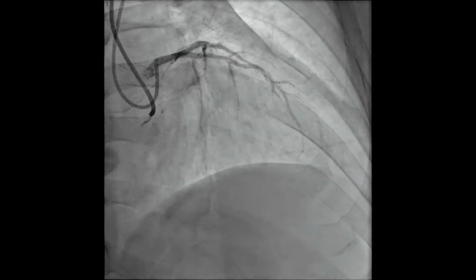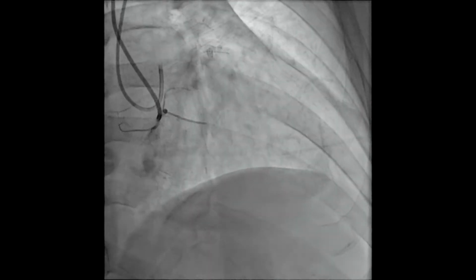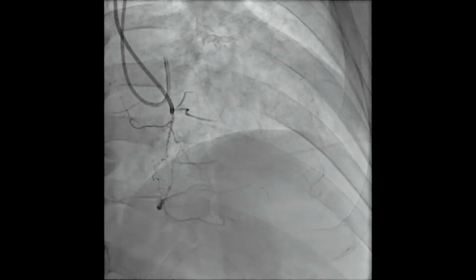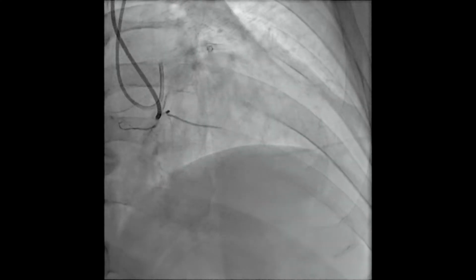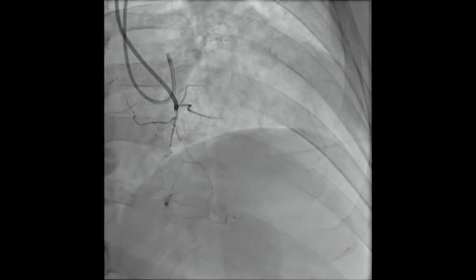So a case. This is a 56-year-old man who had a non-STEMI, had a circumflex PCI, and just like 20% of patients who come to the cath lab, was noted to have a CTO as well of the right coronary. He never felt great after his circumflex PCI, so he came in for evaluation. He was on 3 antianginals with a great blood pressure. Stress testing showed inferior scar with peri-infarct ischemia, and the entire inferior wall was viable on MRI.